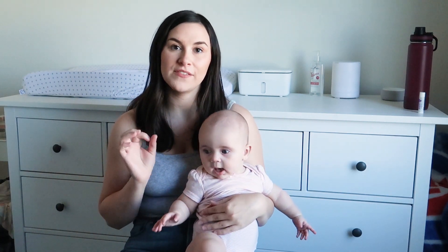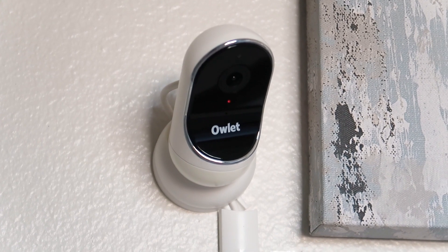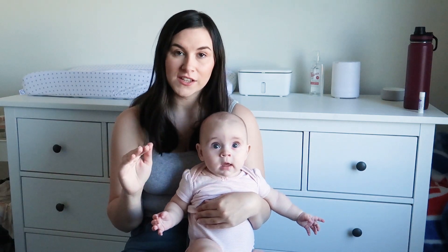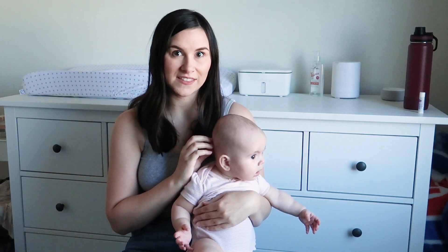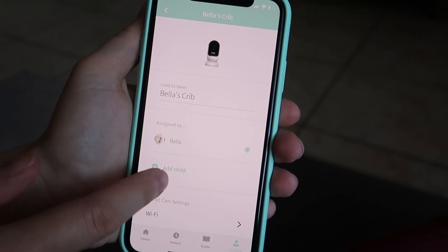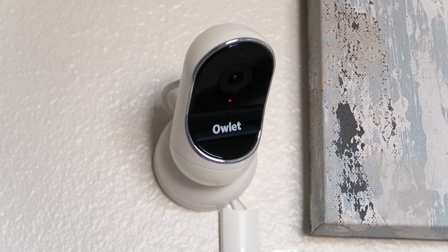Another con is that the camera has a status light. It is really bright and it changes color when you access the app to monitor your baby. We often found she would be staring at the light and it would distract her and keep her awake. You can go in the app and turn that feature off, which we did. I don't really see the need for that status light because the baby doesn't need to know if you're watching.